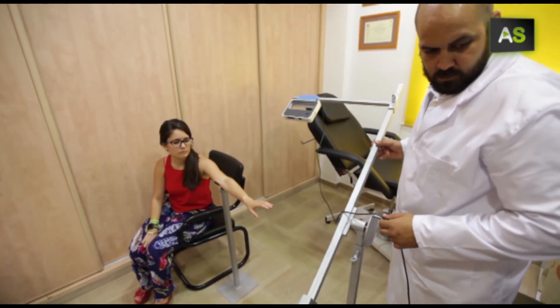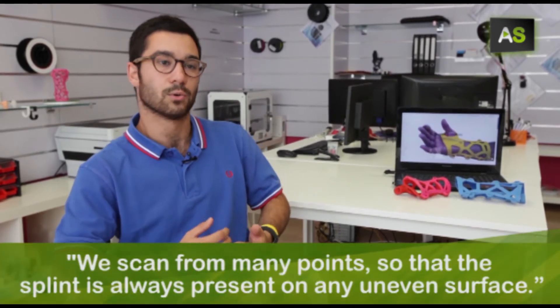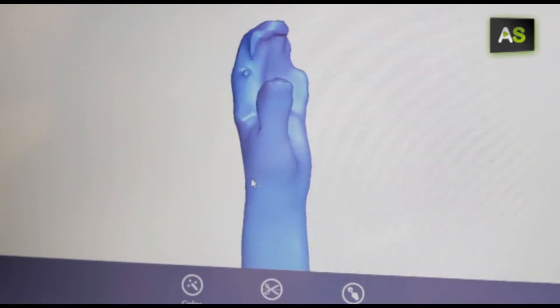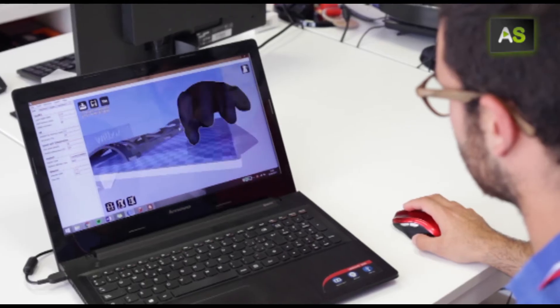This is done at the Orthopaedic Clinic. It is scanned by many points, so that any surface or rugosity is always captured. With the image scanned, they proceed firstly to the design of the splint and then, after uploading it onto the platform, to the 3D printing.